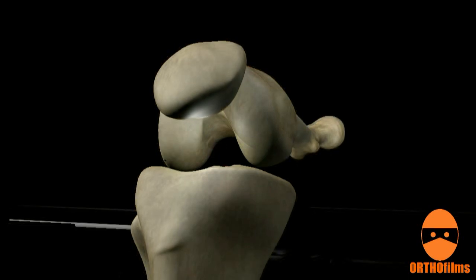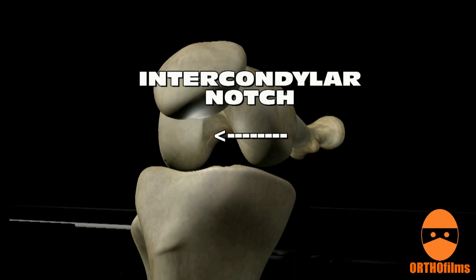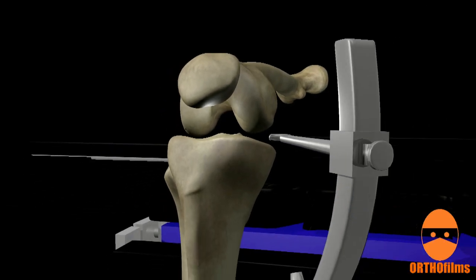The intercondylar notch, the site at which the new ACL graft will attach to the femur, is prepared. Tunnels are drilled in the tibia and femur.